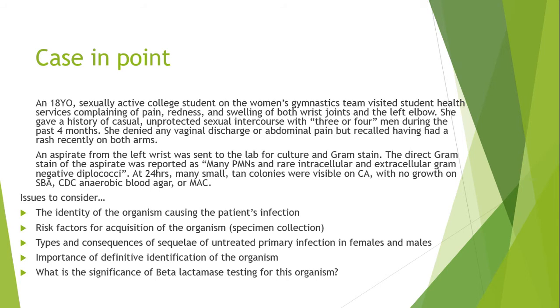So what do those results tell us here? We don't have any growth on MacConkey. Does that correlate with our gram stain? What does MacConkey grow? Gram-negative bacilli. And does that correlate with our gram stain? Do we have any gram-negative bacilli in our gram stain? No, so that looks good.